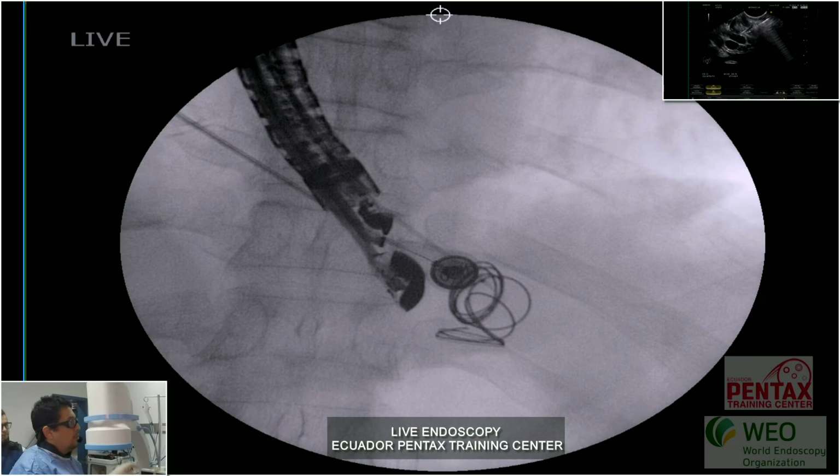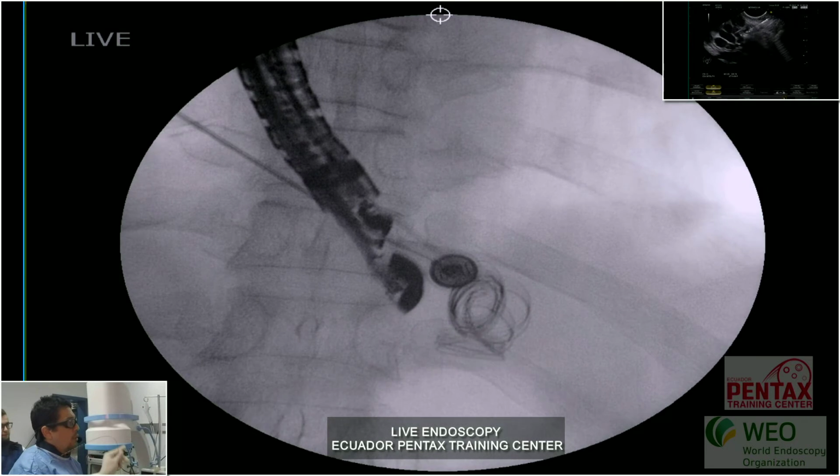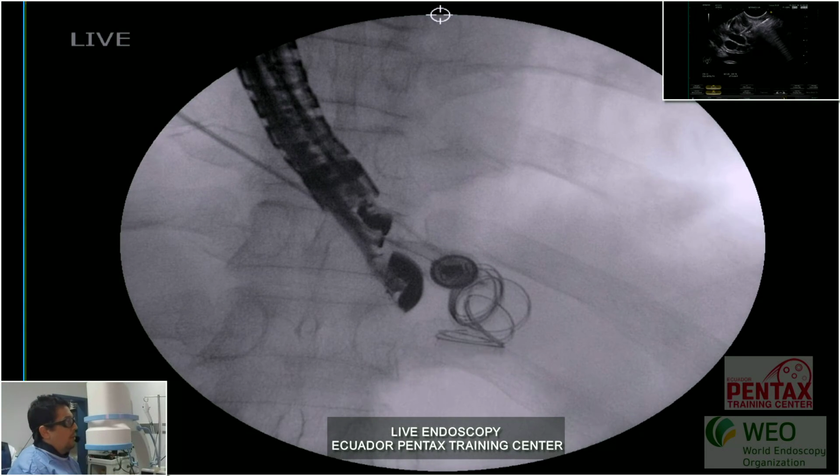So we have two coils and I will put another one. In this case, because the varix is very big, okay? So we need to put a very good coil pack. We don't need to have any space between the coils before we put this cyanoacrylate injection.